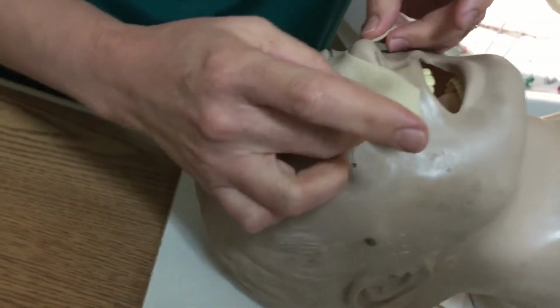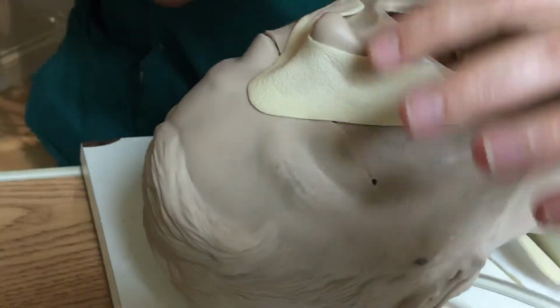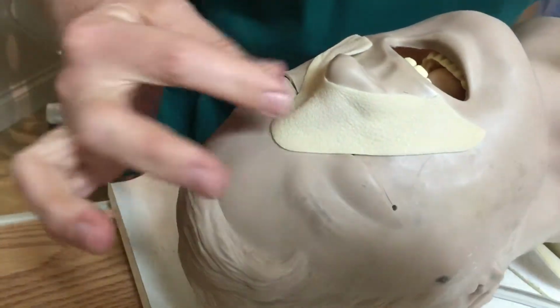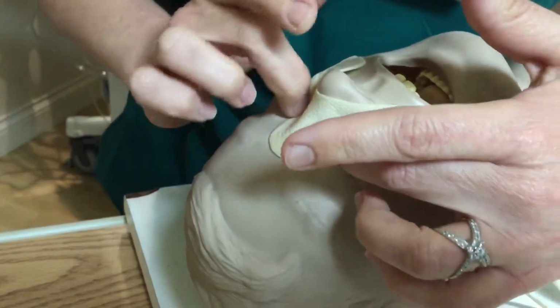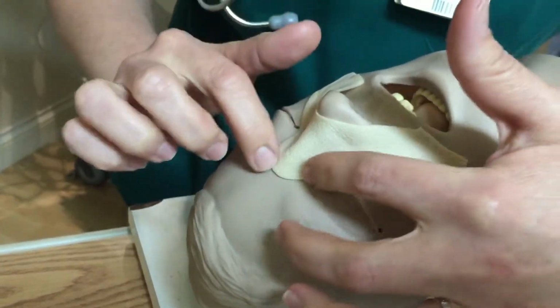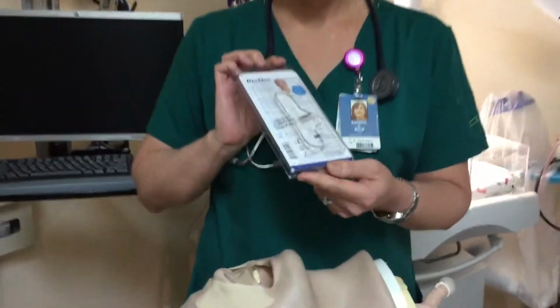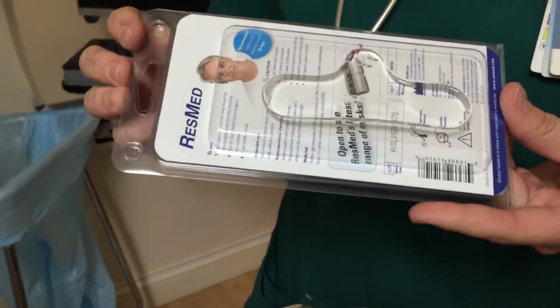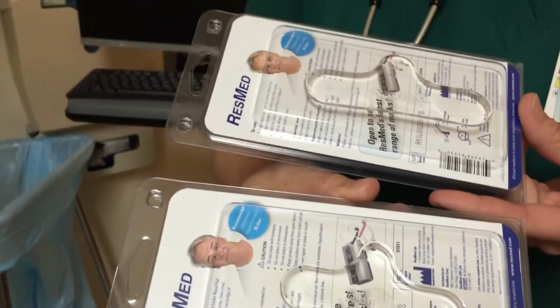It places over the nose bridge, just like this. Make sure you don't occlude the nares, and it adheres. Try not to get into the eyes. We can make it smaller if we need to. Now, if the patient needs to stay on the BiPAP for longer than 6 hours, we're gonna move the patient over to the Gecko. So there's two sizes. There's a small and there's a large.